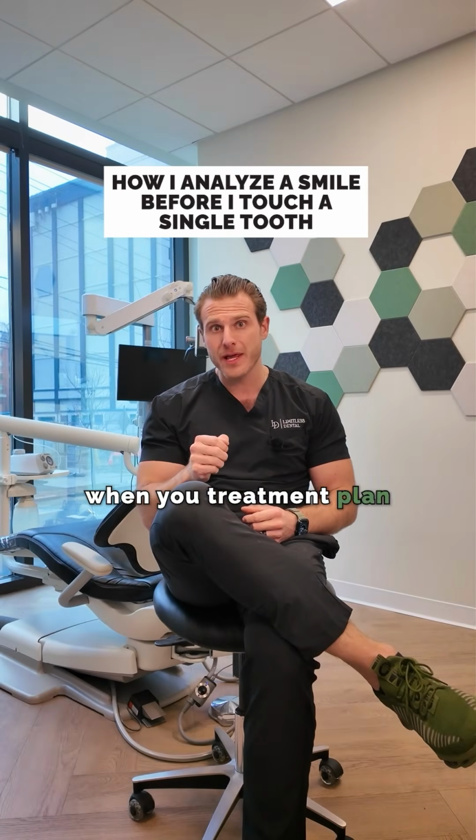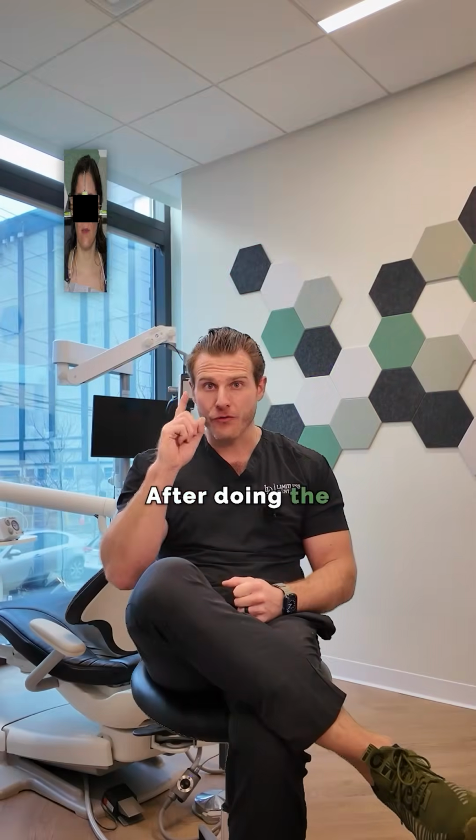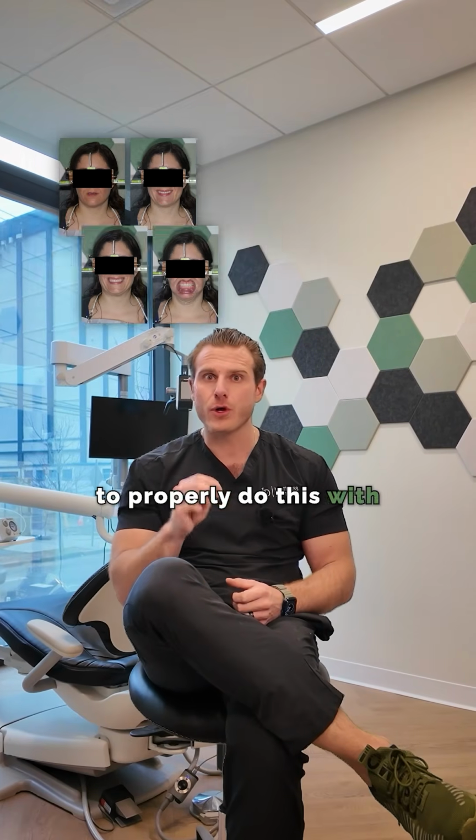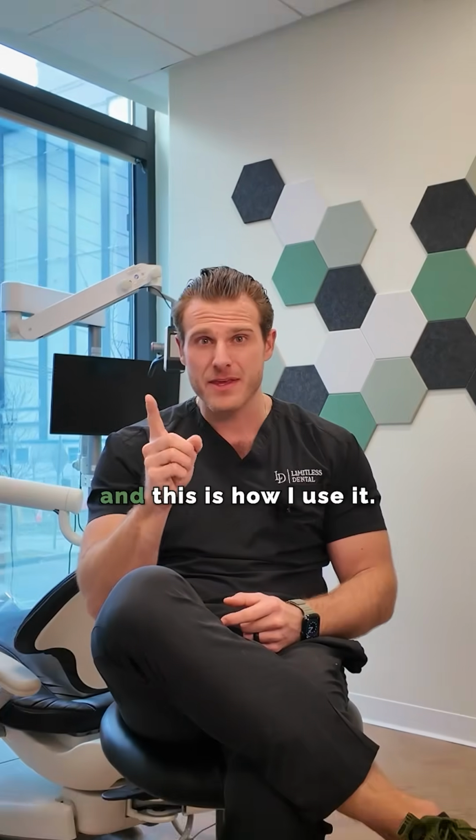Stop guessing when you treatment plan and start systematizing with a dental facial analysis. Shout out to John Kois. After doing the 4 required photos to properly do this with the Kois 2.0 glasses, then you can send it to Evident Digital to get the DFA. And this is how I use it.